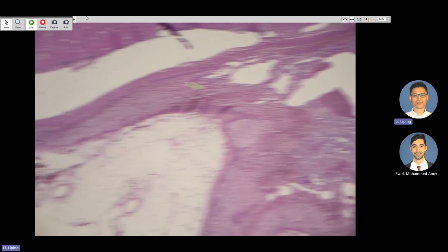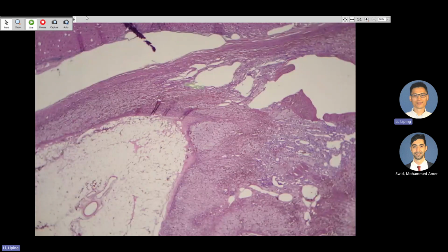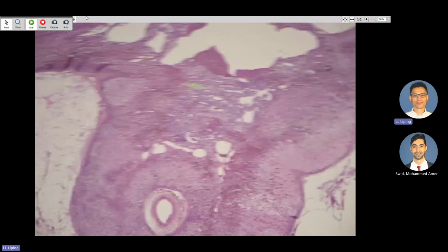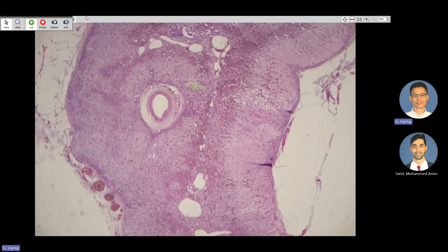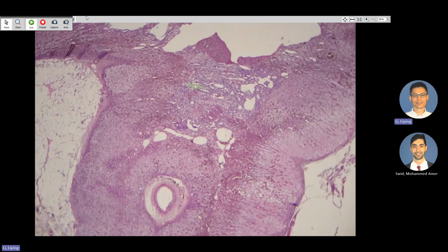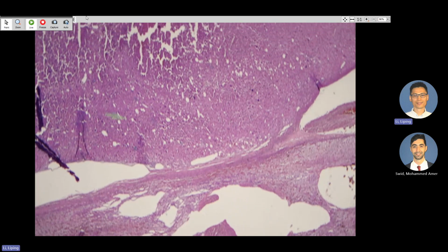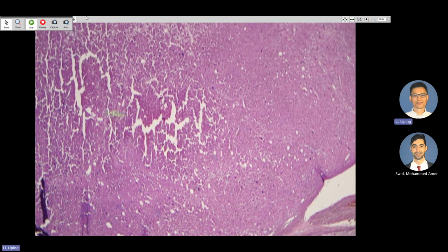This one we can see the classic triangle shape of the adrenal gland, right? So next time at low power, you can tell maybe this is the medulla area, really bluish, and then our three layers of normal adrenal gland. And then we have this well circumscribed tumor here.